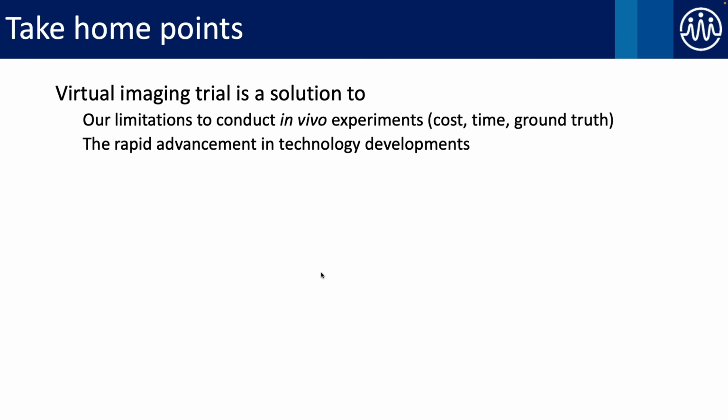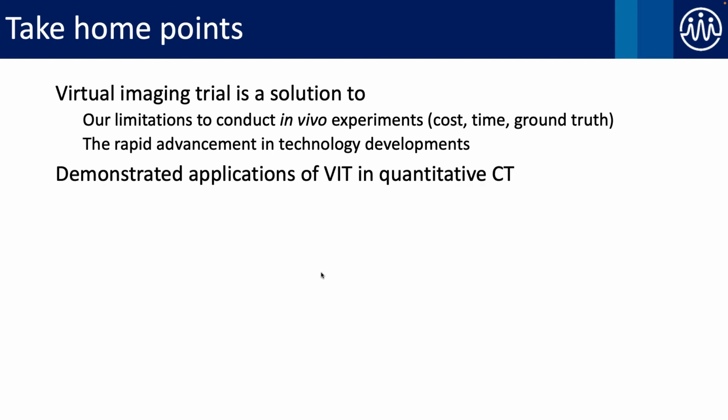So, some take-home points. I demonstrated that virtual imaging trial is a solution to our limitations to conduct in vivo experiments because of the cost, time, and ground truth. And it's also a solution to the rapid advancement in technology developments, because you don't have access to the scanners or you don't have enough time to conduct those experiments in real life.